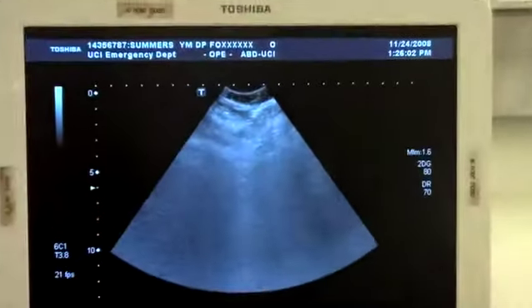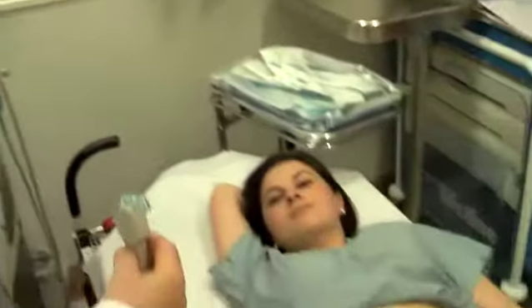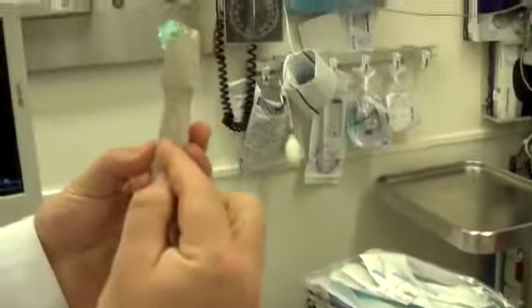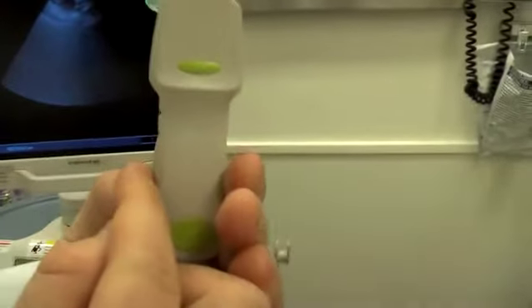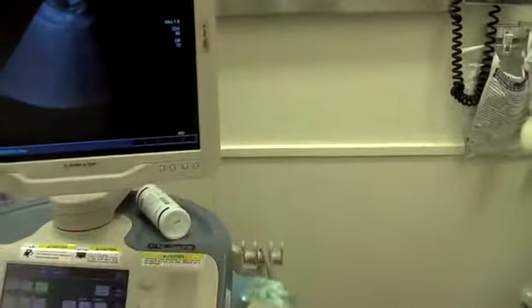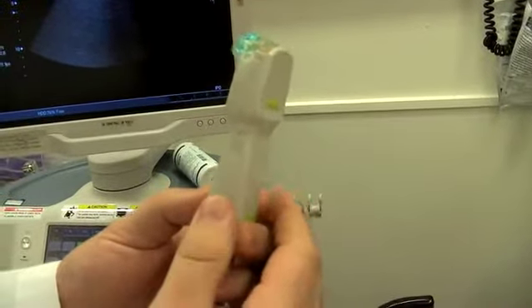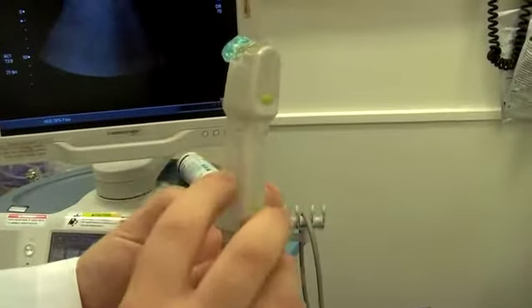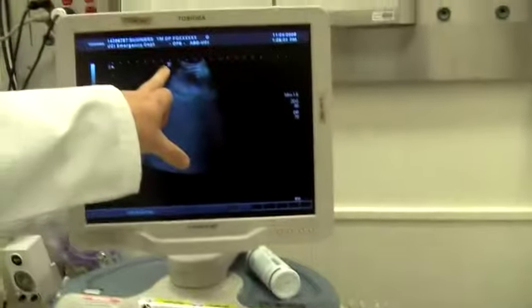Okay. Now, another thing about the probe when you do ultrasound scanning is this is the indicator or the index. This should always be to the patient's right or to the patient's head when scanning. There's only one instance where that rule does not hold true, and that is in the parasternal long axis view of the heart. But otherwise, if you keep the index to the patient's right or the index to the patient's head while scanning, and you make sure the indicator's in the upper left-hand corner of this ultrasound screen, you'll be okay. All of your orientation will be correct.